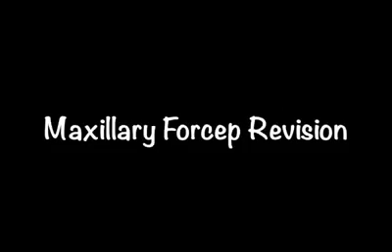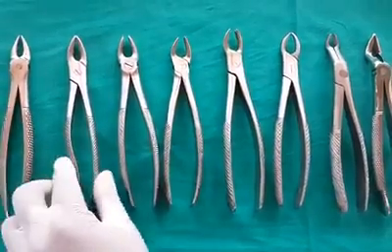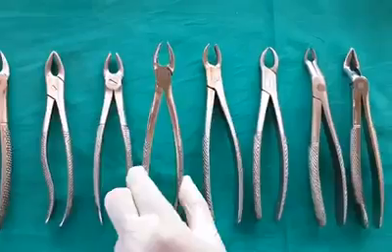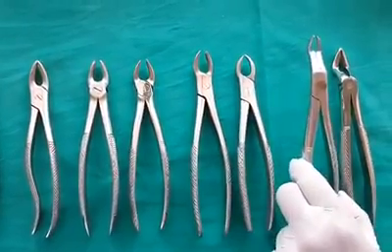Forceps revision — Maxillary forceps: anterior forceps, premolar forceps, molar forceps, cowhorn forceps, third molar forceps.